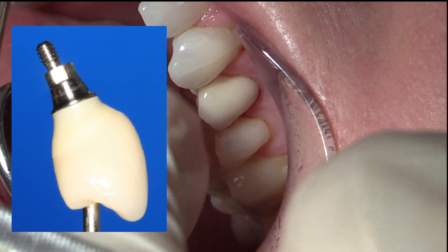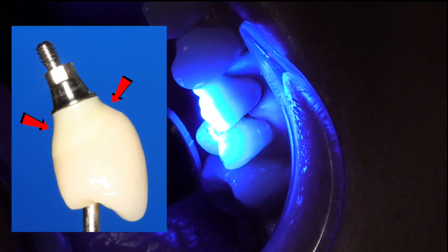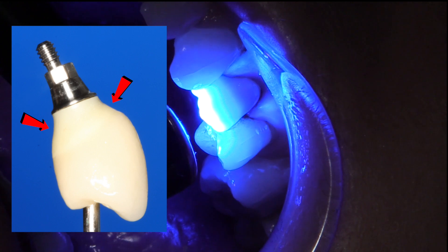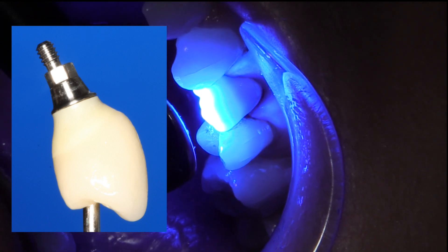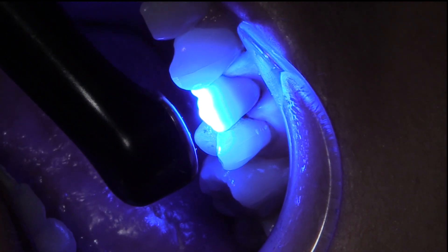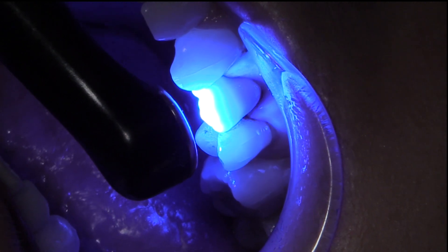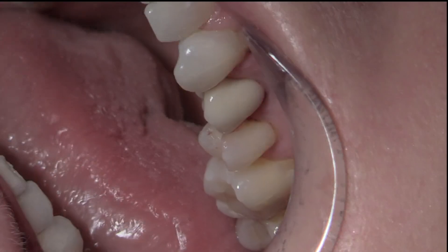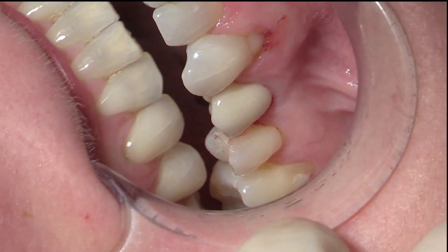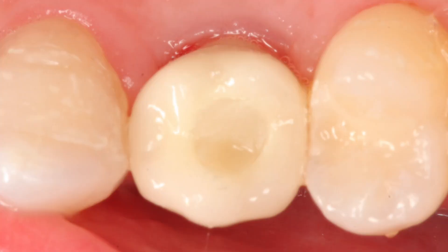Looking at this abutment one more time, the problem is the emergence profile down to the implant size — it's like a wine glass, and so cement gets caught up in this area. You can't see it on x-ray, so we have to rely on tactile feel to get the cement out because the tissues are a little bit looser around an implant. When the cement gets stuck in these areas, we have to be really diligent about getting it out. The ASC is a great way to get the option to go screw-retained on these cases.